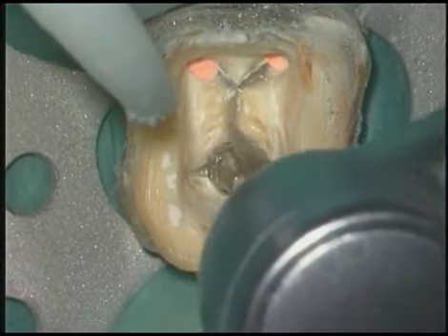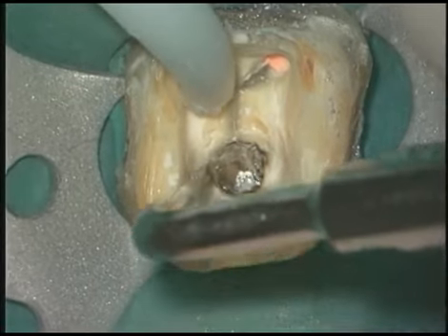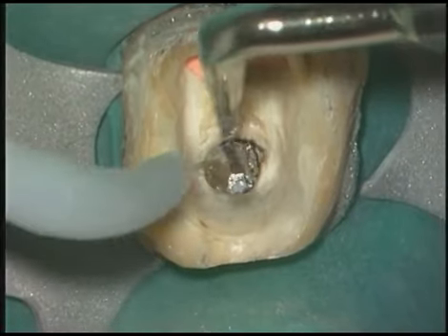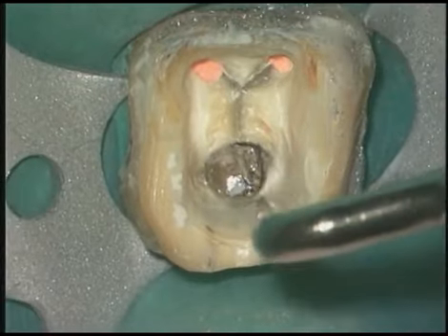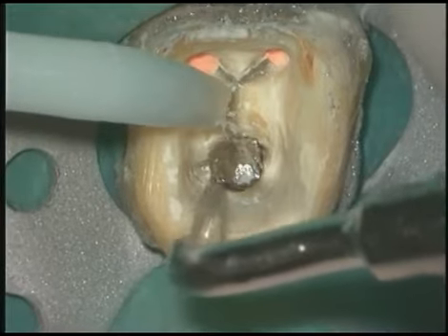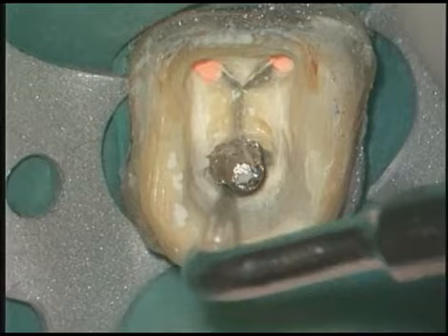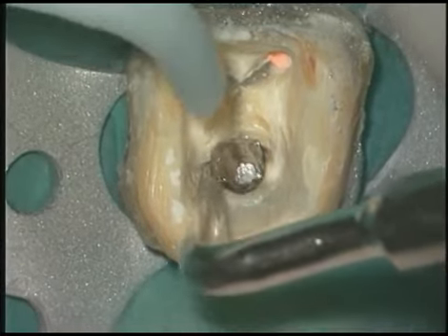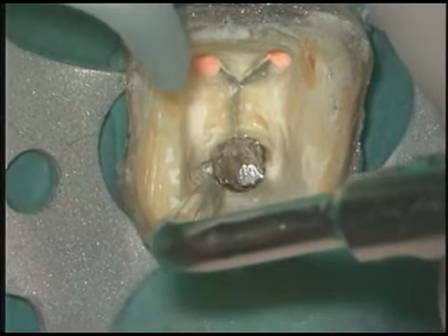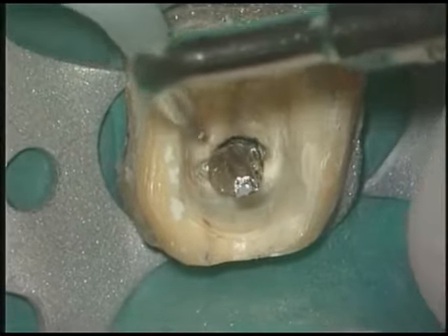If the RotoPro loosens the post but does not jettison it out of the canal, then proceed to an efficient ultrasonic instrument, like in this situation, an Endo 2. Learn to place that instrument between the lateral wall and the post, which will wedge, intend to displace and kick the post up coronally. I'd recommend safety glasses because these posts can oftentimes leave the root at considerable velocity.